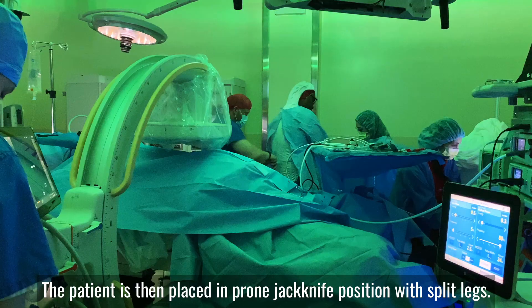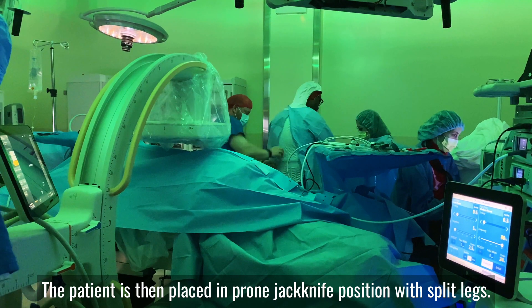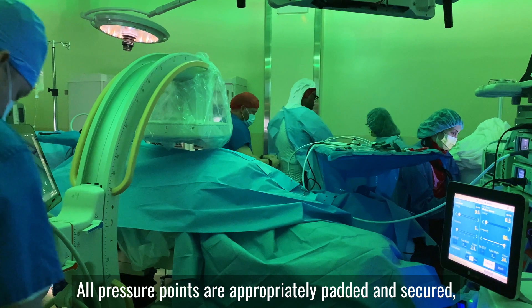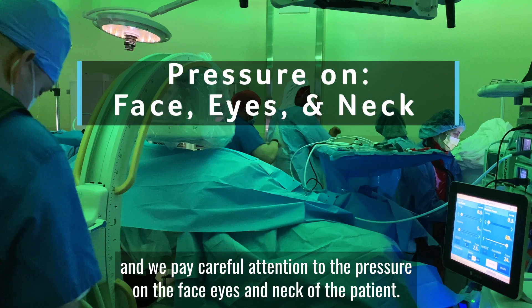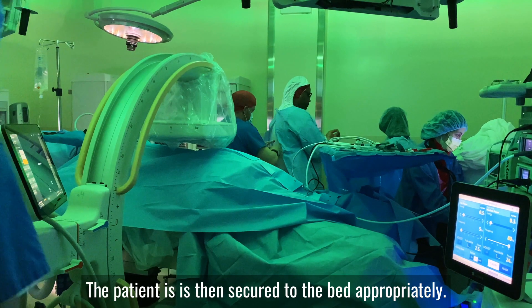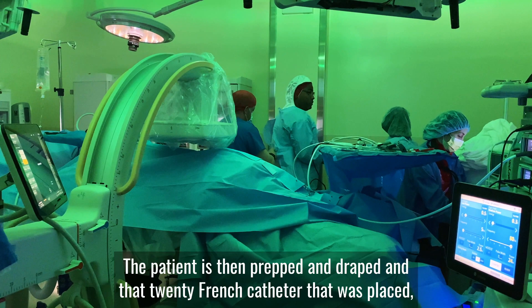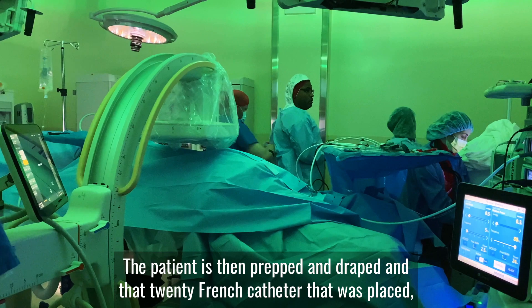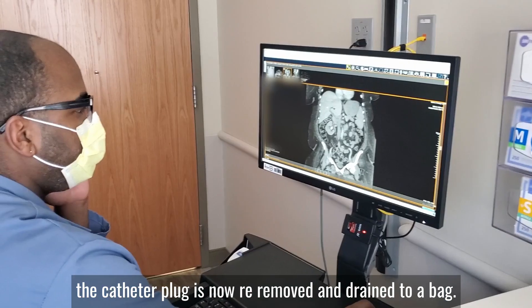The patient is then placed in prone jackknife position with split legs. All pressure points are appropriately padded and secured, and we pay careful attention to the pressure on the face, eyes, and neck of the patient. The patient is then secured to the bed, prepped and draped, and that 20 French catheter plug is removed and drains to a bag.